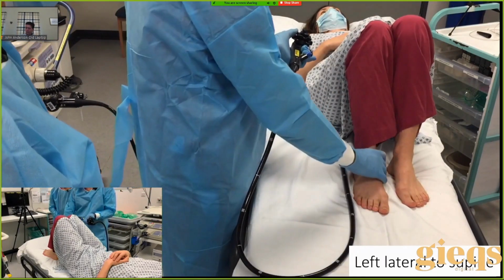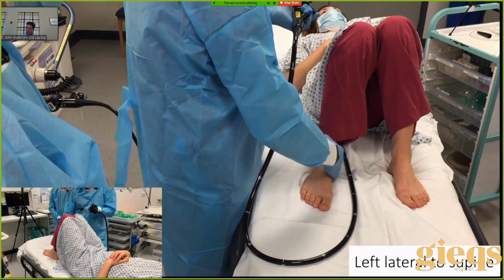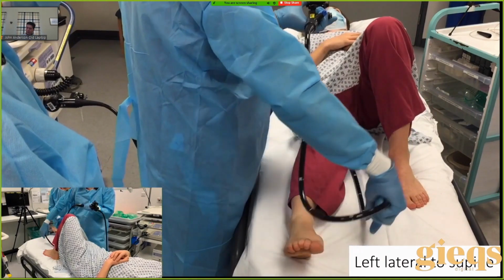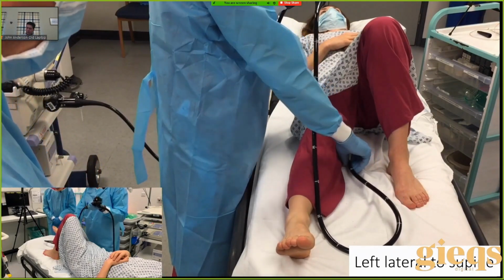We ask the patient to move their left leg over the scope like that, and to optimize control of the scope, we will get the patient to straighten the leg out, and then we've got free movement of the hand. The hand's not restricted by the leg, and we can control the scope nicely like that.